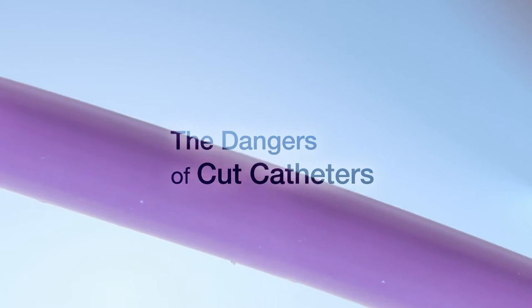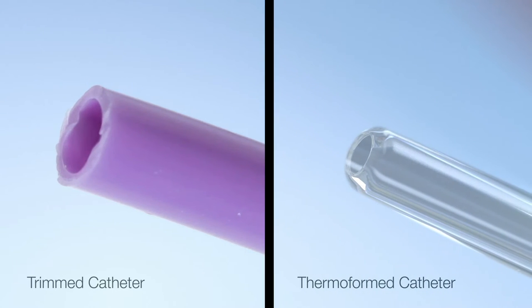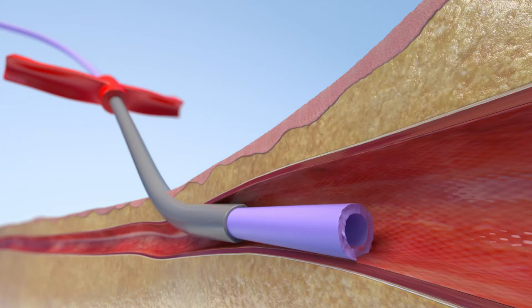It is known that trimming a catheter, no matter how sharp the device used, leaves a jagged edge. Not so with manufactured catheter tips. With the modified Seldinger technique, MST, this jagged tip is then placed into the vessel through a sheath introducer, most likely causing some degree of initial injury.